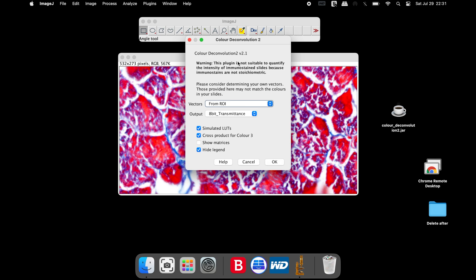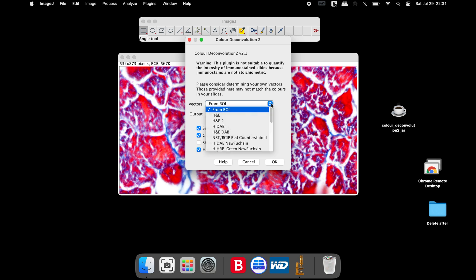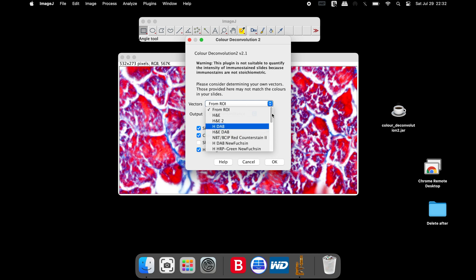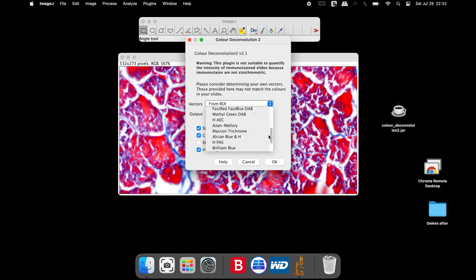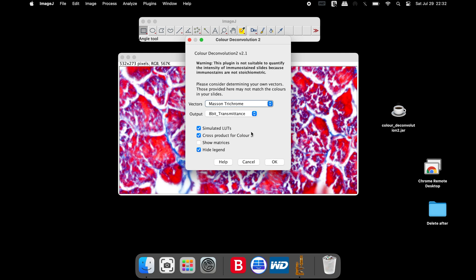In the Color Deconvolution 2 window, the vectors and output need to be changed according to the type of image. Head to the vectors and click on the drop-down to find the appropriate staining method used. If the staining is an H&E staining, users can select this option. Similarly, users can also change to H&E DAB if required. For Mason's trichrome staining, scroll down to find the Mason's trichrome and select the option. In the output drop-down, select 8-bit transmittance.